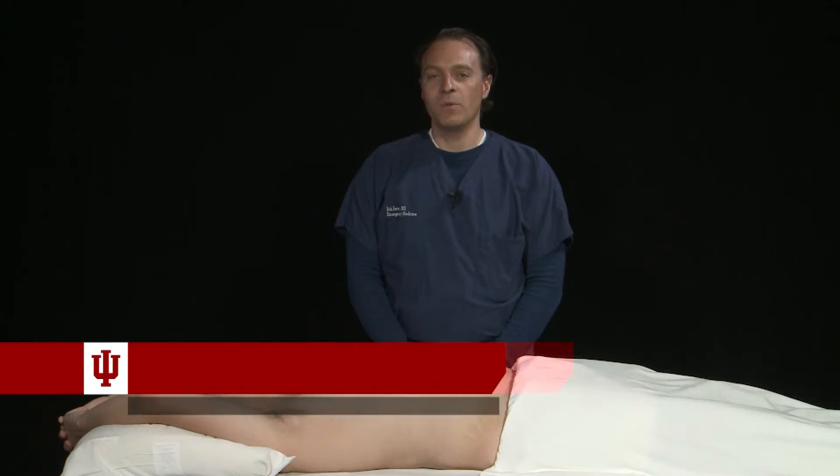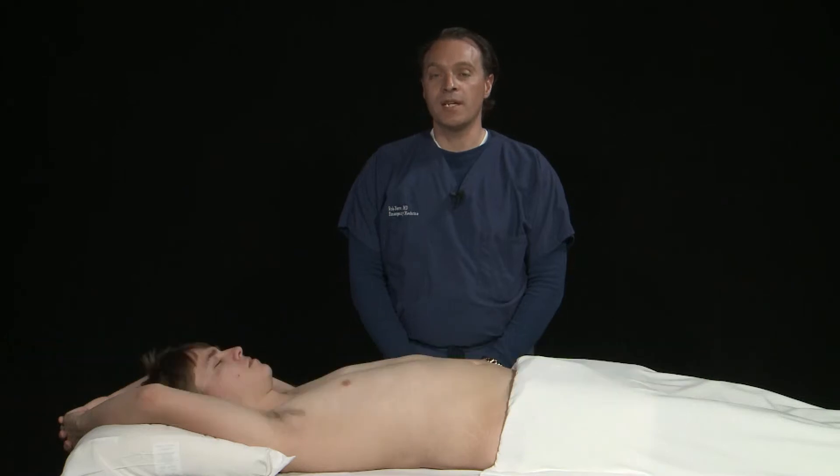When performing a renal exam, we are going to image both the right and the left kidney in the long axis first and then the short axis. Then we're going to move to the bladder where we'll image again in the long axis as well as the short axis.